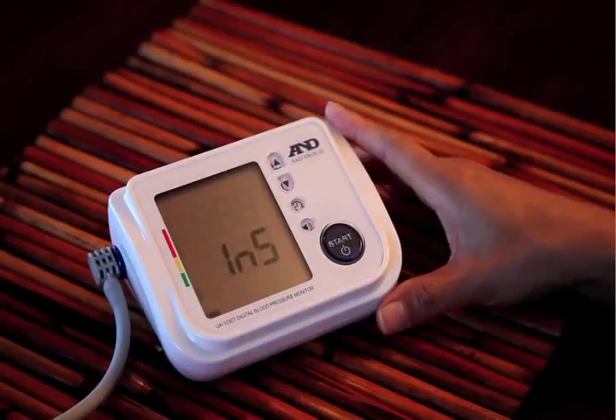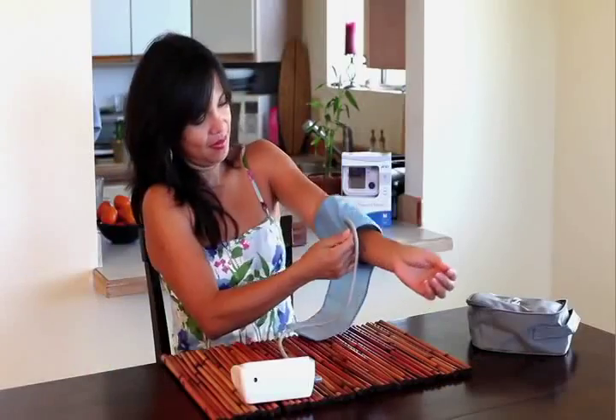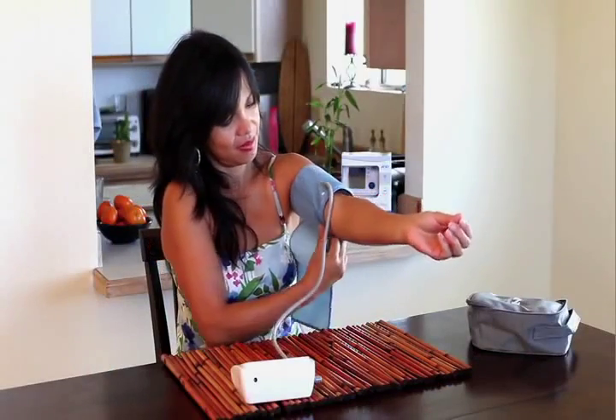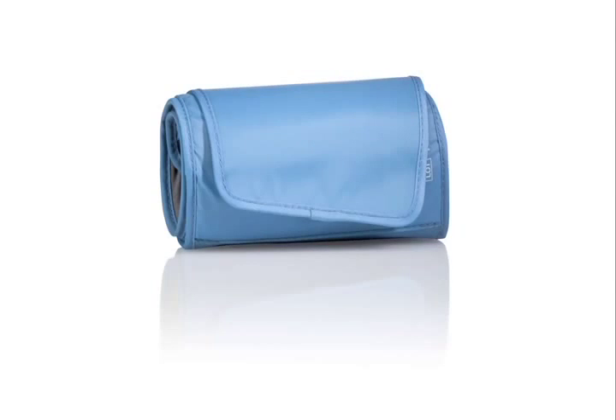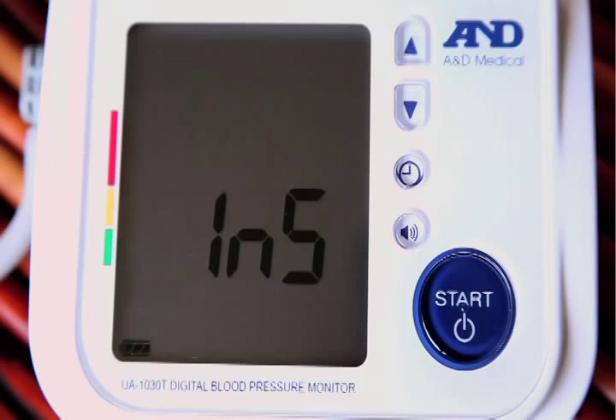Press the start button to begin verbal instructions. Place the cuff on your left arm. Our SmoothFit cuff is designed to accommodate arm sizes from 9 to 14.6 inches. Press the start button when you are ready to begin.